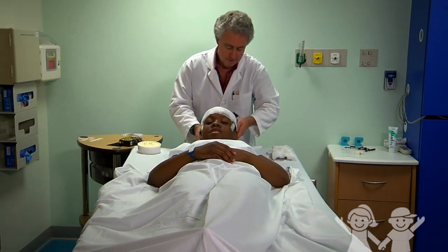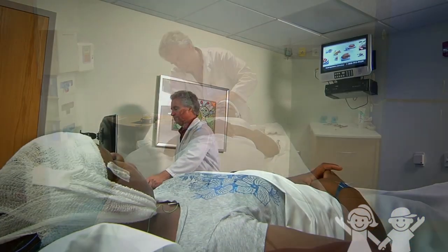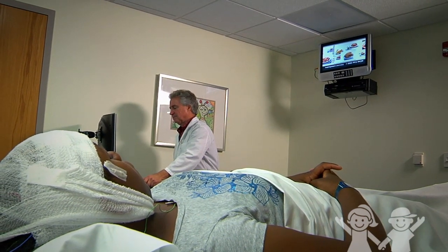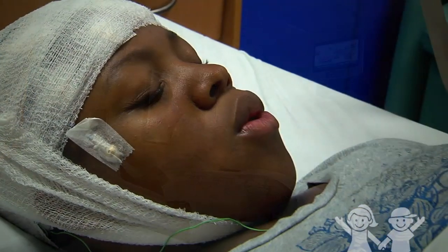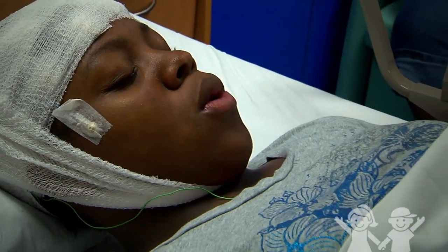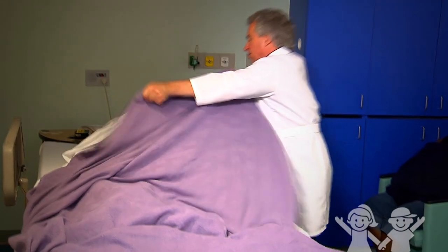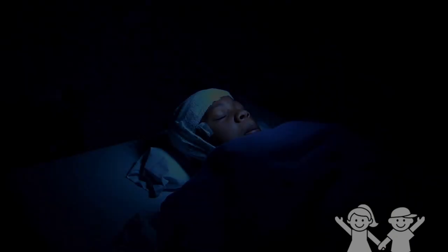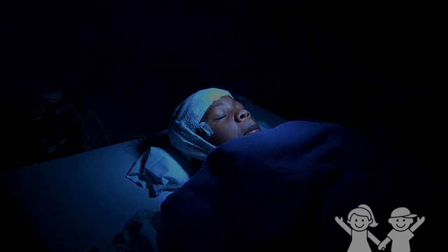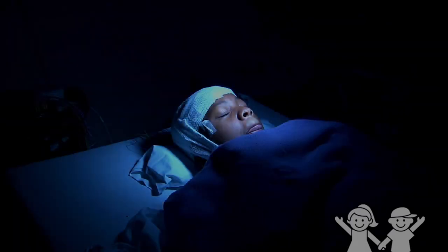After the technician checks all the sensors, there are 4 different parts to the EEG. First, the technician will take a base reading while you are awake — you can relax and watch TV during this part. Then you will breathe quickly for 3 minutes. Next, the technician will turn out the lights and you will sleep for 10 to 15 minutes. The last part uses a series of flashing lights to test your reaction. You can keep your eyes closed through this part, as long as you don't go to sleep.